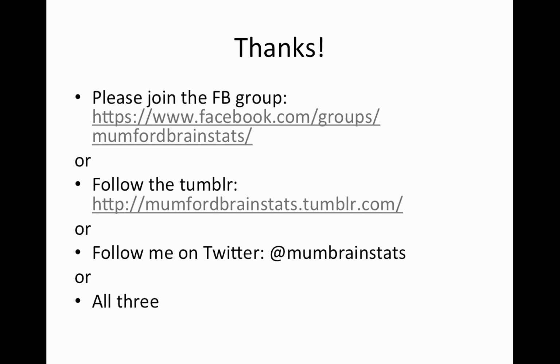Simply opening all those in FSL view and checking them will keep you busy. And I know you might be tempted to not do it, but it's always good to look at your data and make sure it looks great, especially if you're in the process of acquiring your data. You want to fix any issues at the scanner. You want to fix them now. If your structurals are in bad shape and you're not getting good image registration, which we'll get to in a few weeks, you want to catch it now so you can fix it.